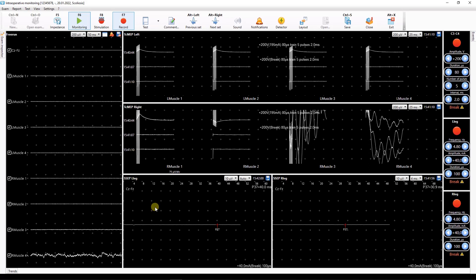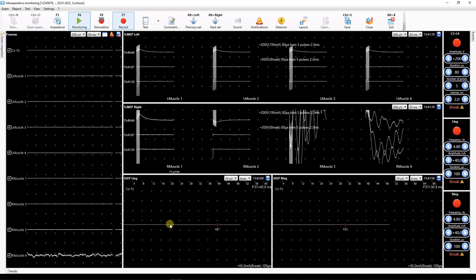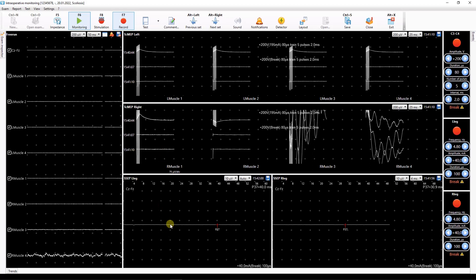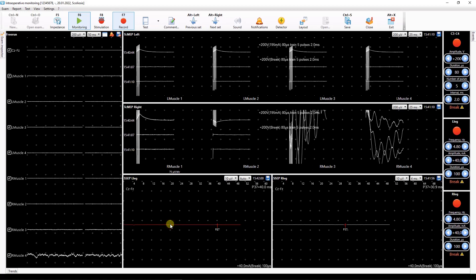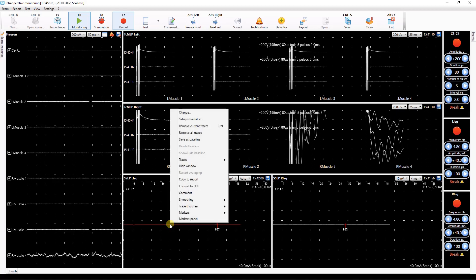The current traces can be marked as baseline. Those are traces that will be compared with ones obtained during the monitoring process. To mark the traces as baseline ones, select the traces and use save as baseline context menu command.